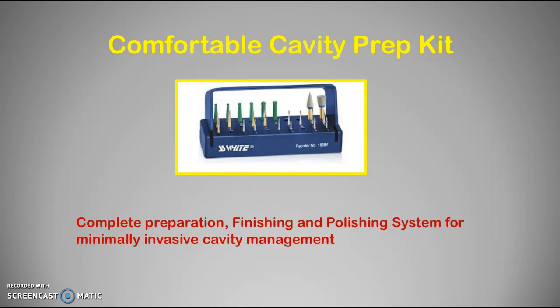One of the ways I do it is by using this comfortable cavity prep kit. In my clinic, it has a complete set of tools for accessing the lesion in a minimally invasive method and finishing it off by finishing and polishing. Let's go through these tools so that we know what and how they do it.